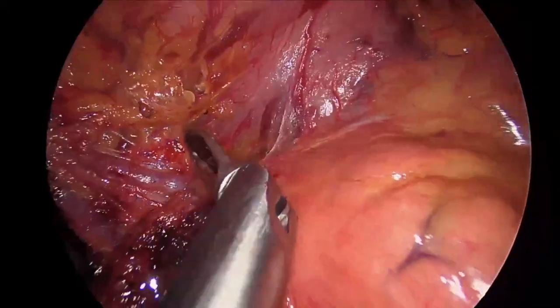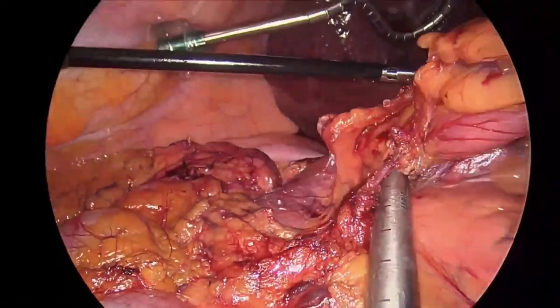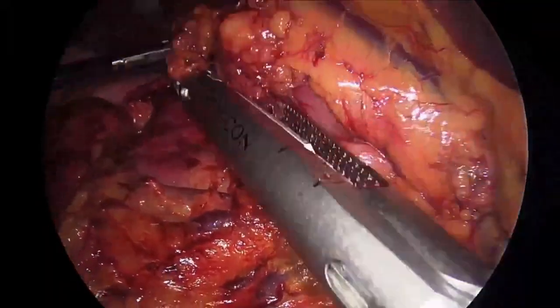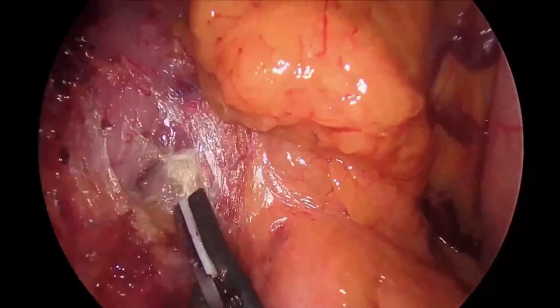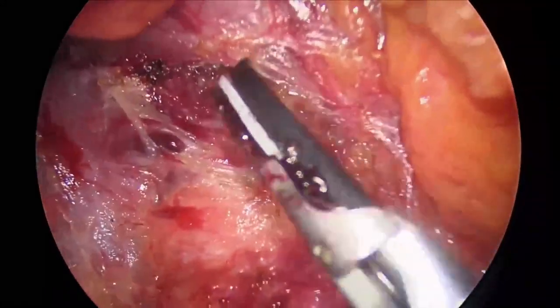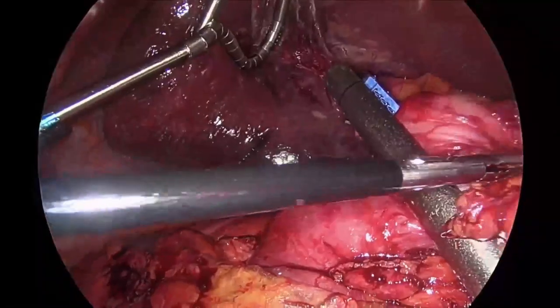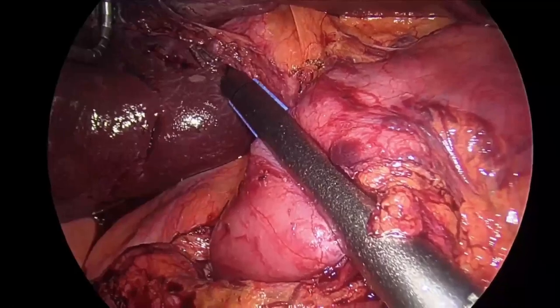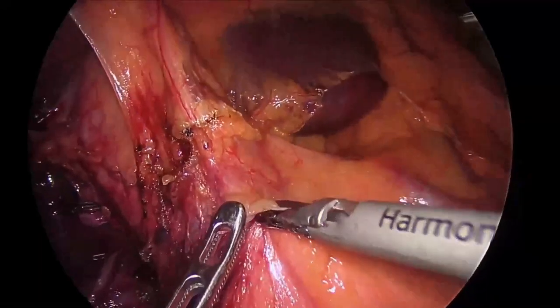At this level, the vessels of the trunk of Henle are surrounded 360 degrees, and stapled and divided en bloc. The duodenum is then lifted anteriorly and a window is created on the first portion of the duodenum distal to the pylorus. A stapler is placed and 2 to 3 centimeters of duodenum distal to the pylorus are maintained.